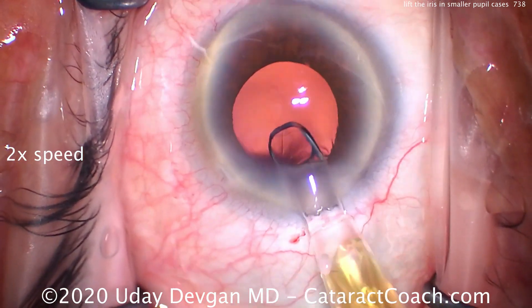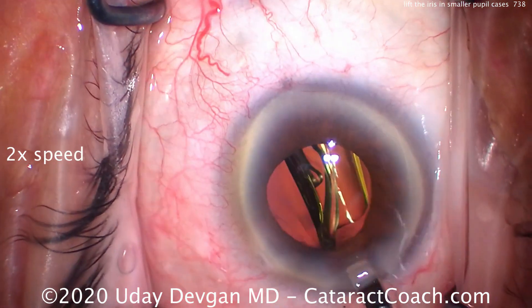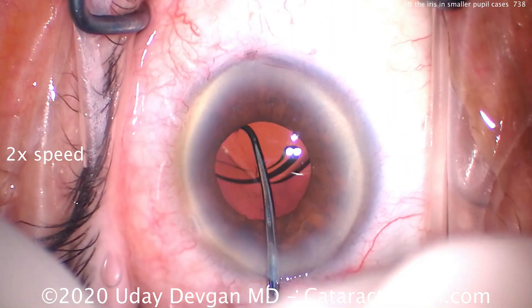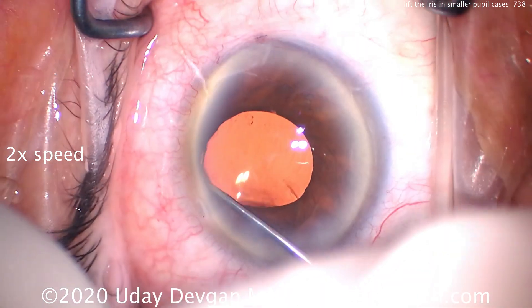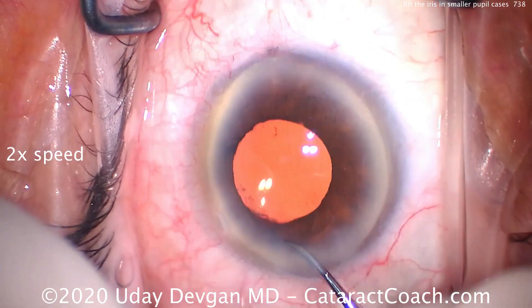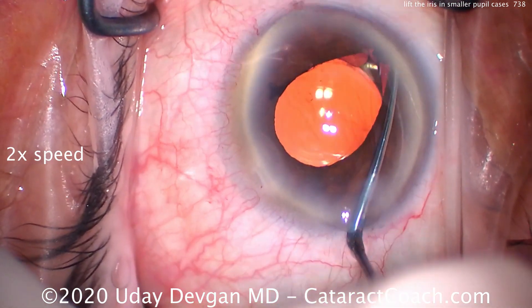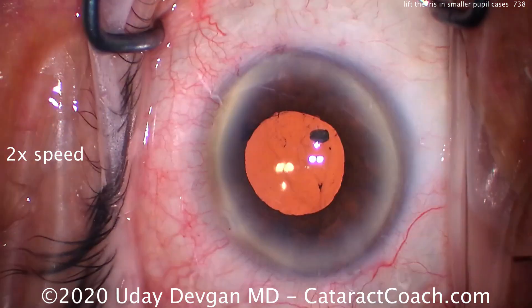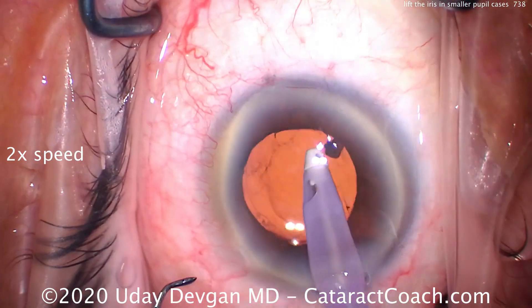Another case — let's take a look. Again, putting the IOL inside the capsular bag. That goes in very nicely and the dilation is not terrible here; it's probably about a five millimeter dilation, maybe four and a half millimeters. But when we lift up the iris and look all around, we sweep here and check 360 degrees. And we come back here — what is that? Surprise, surprise! There's a nuclear fragment that's left behind.